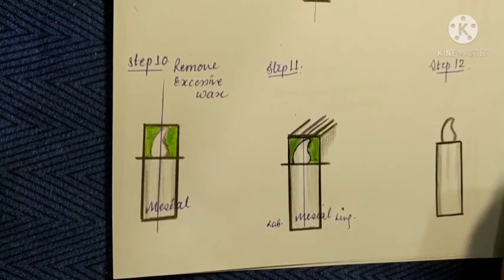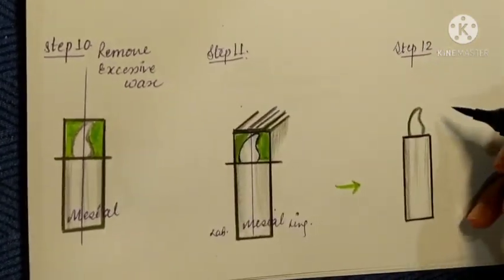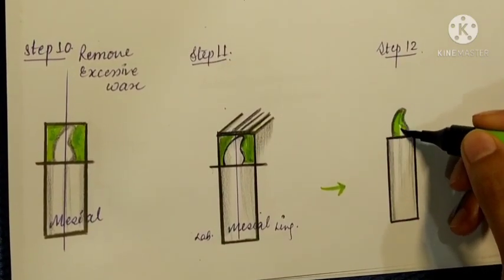Now moving to the next step. After doing all this, we got our crown. This is our crown.